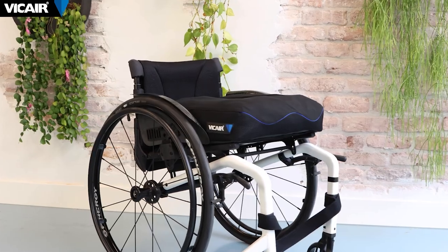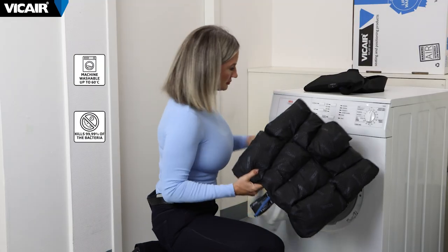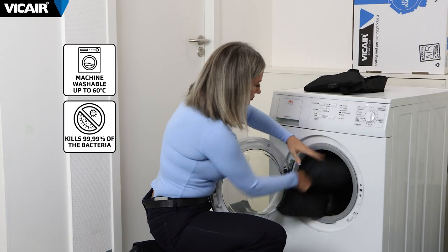We recommend frequently checking for redness of the skin and for bottoming out, especially when first using any wheelchair cushion. The Vector O2 is easy to use — there's no pump or additional equipment needed to utilize the cushion. Furthermore, it is machine washable in its entirety.